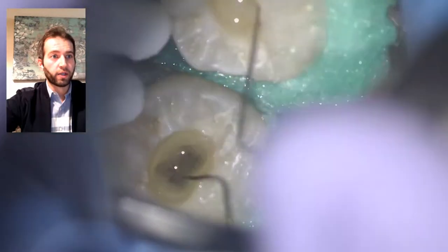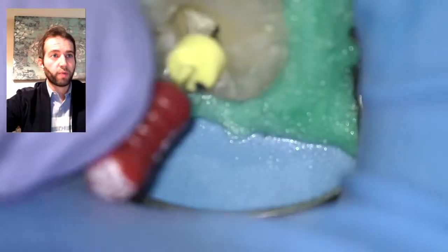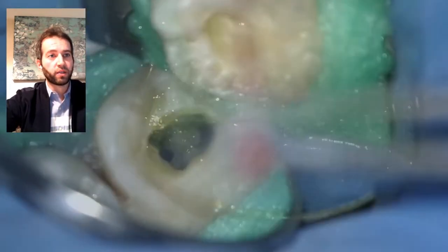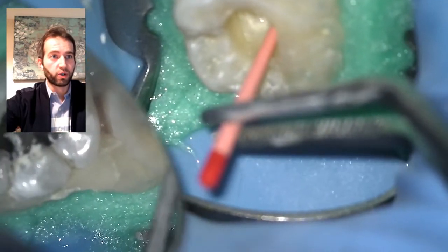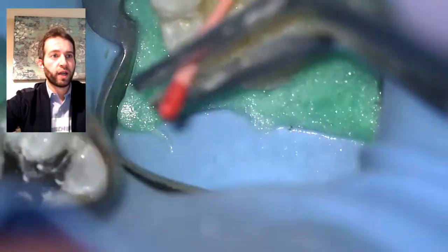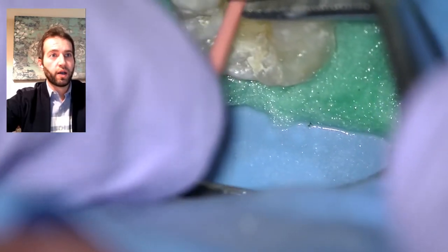Everything gets dried out and then we'll be ready for obturation. I'm using my final apical prep in a hand-file fashion with an apex locator just to gauge patency, going back to a size 20 to confirm patency, then going beyond the apex, then I proceed with matching gutta-percha points. This is a 25/04, which is my finishing size, and I'm making sure I have a good tuck-back and that it fits to the working length.